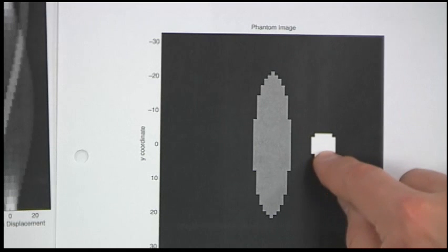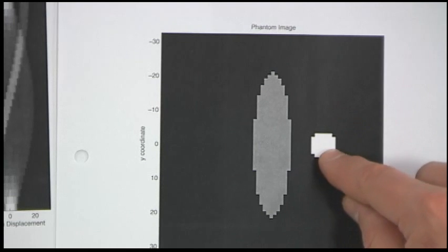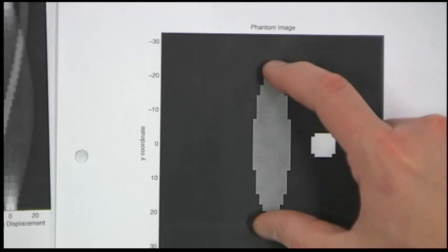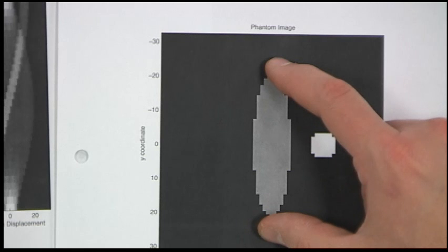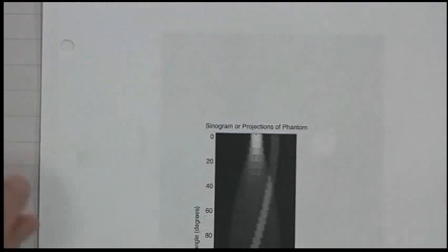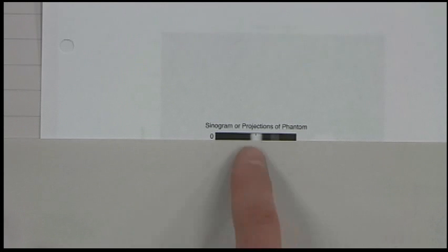I mean, I don't have actual values here, but this doesn't look like it's numerical. The numerical value is twice as large, and this is much more. This is maybe like 5-6 times longer. So when you actually, this is the result here. That function right there at the top is the projection, and sure enough, you have one bright projection, a large integral density, and one less bright, that's the smaller circular thing. So this is the oblong thing.